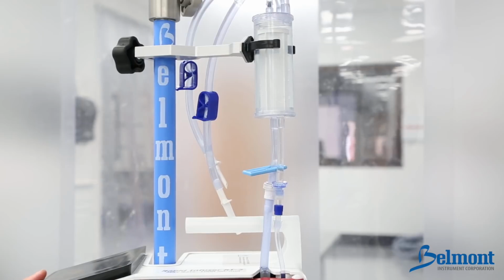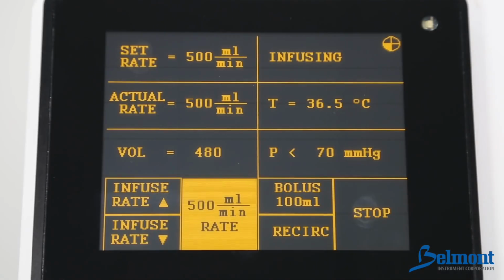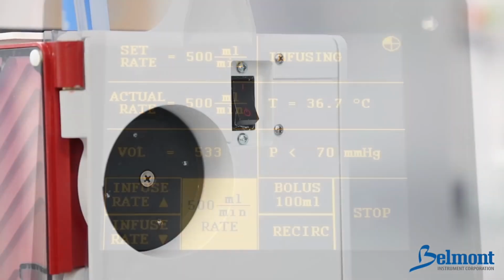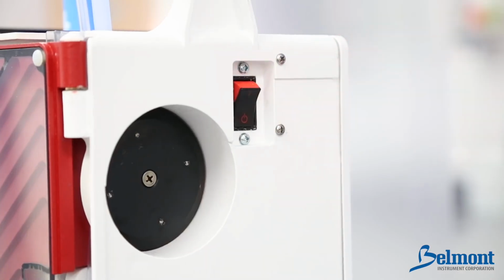As fluids are warmed, gases are formed. The Belmont Rapid Infuser RI-2 will trap these gases within the system and automatically purge them into the atmosphere. When this occurs, "removing air" will be briefly displayed on the screen, and you may see bubbles escape through the recirculation or vent line. At the end of the procedure, be sure to disconnect from the patient and power down by turning off the power switch.